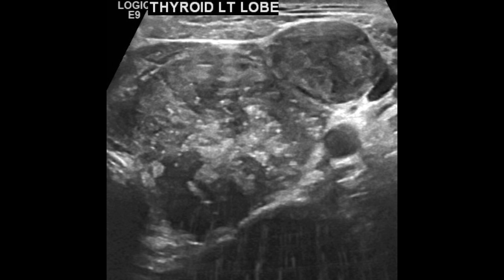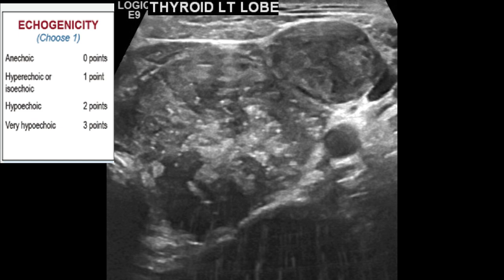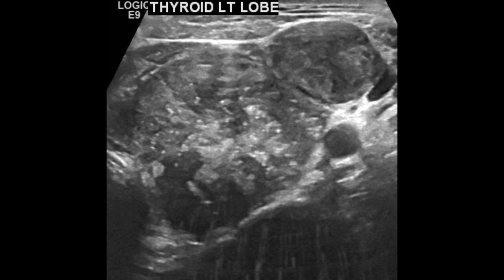For echogenicity, you have to compare the echogenicity of the nodule with the rest of the thyroid. Sometimes when there is no normal tissue left, you may need to compare it with the other side or even the strap muscle. Here, when we compare the nodule, it turns out to be hypoechoic, so we will give it two points for echogenicity.